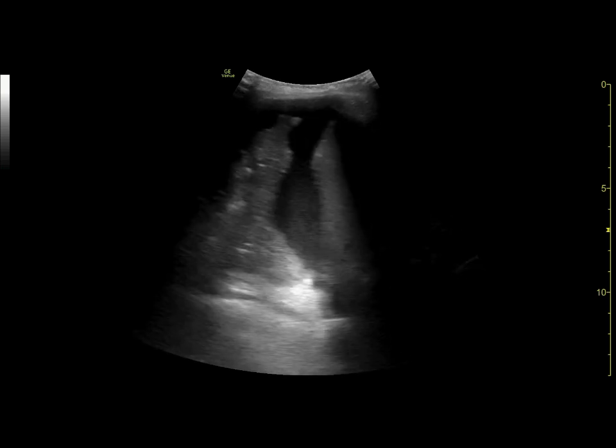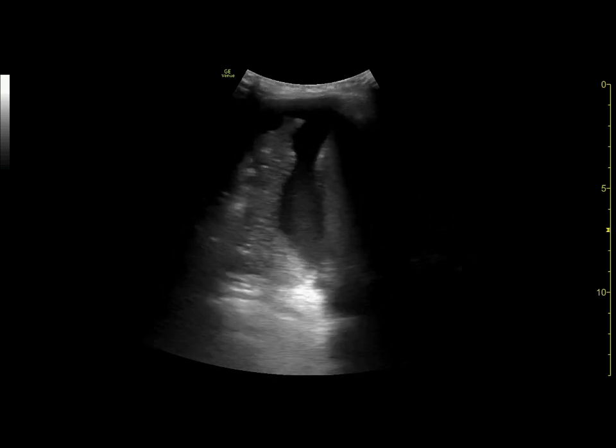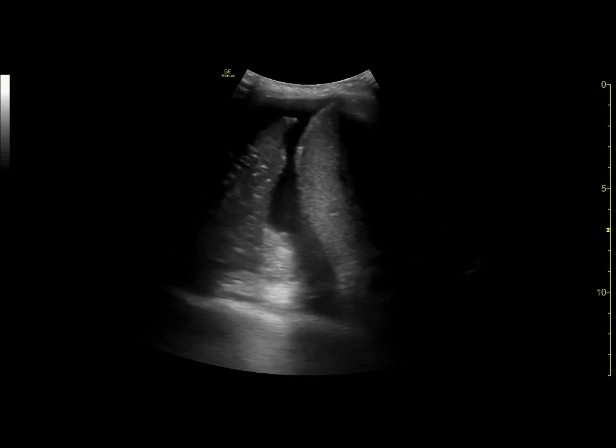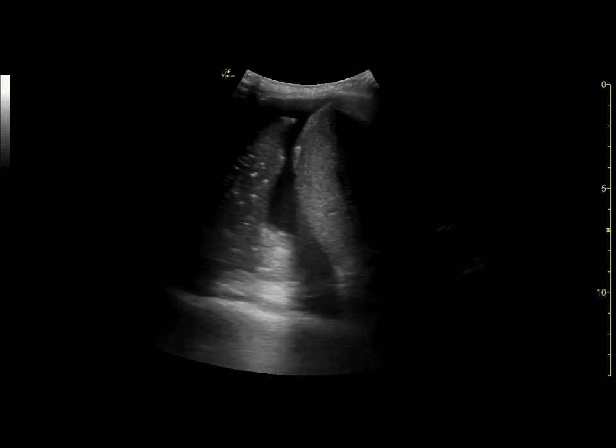A similar effect can be seen in this video, again from a patient with heart failure, and the fluid appears black or anechoic.